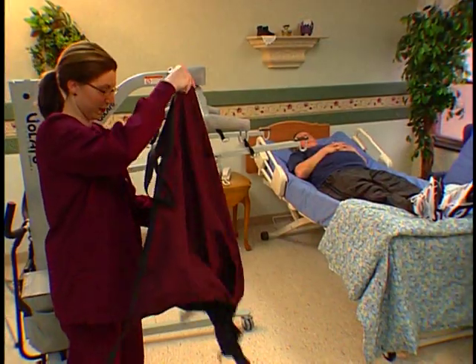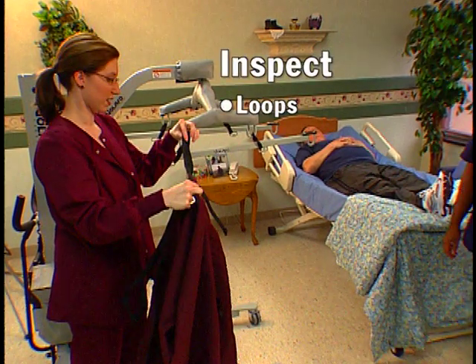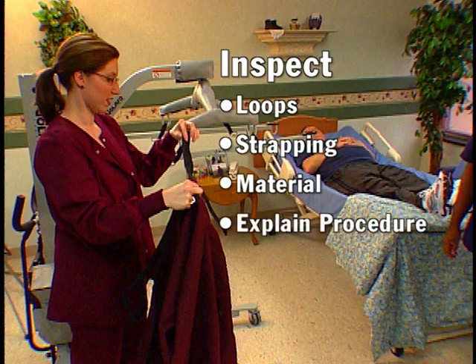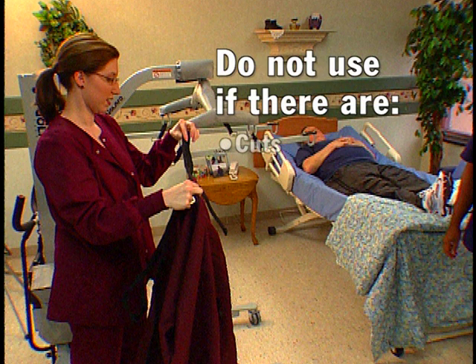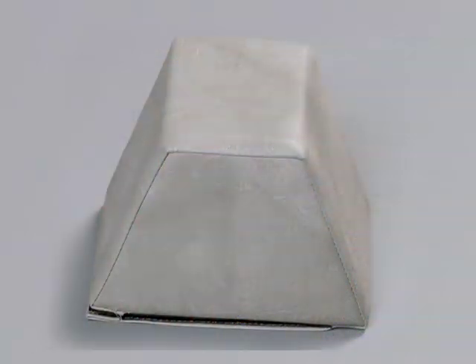For safety purposes, observe the R-bar sling you will be using. Inspect the sling loops, strapping, or sling material and explain the procedure to the resident. If any of these items have cuts, tears, fraying, or loose seams, the sling should not be used. Now you can prep your patient by placing the abductor pillow in the groin area between the knees.